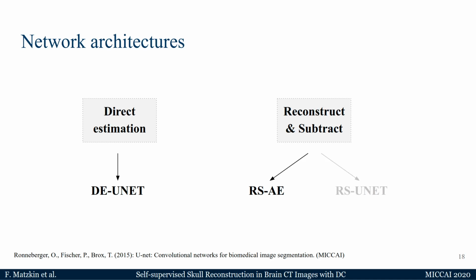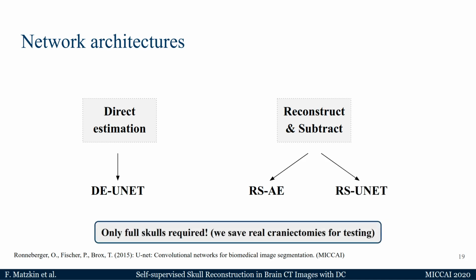We also explored the use of the UNet following the reconstruct and subtract strategy. During training, a random virtual craniectomy is applied before the skulls enter the model, and sometimes salt and pepper noise is added with the goal of removing eventual noise that would occur by the thresholding.